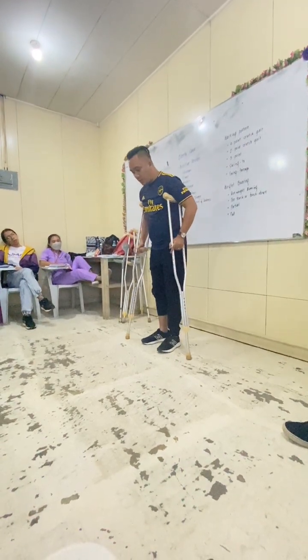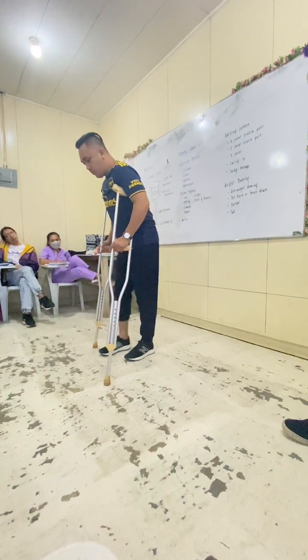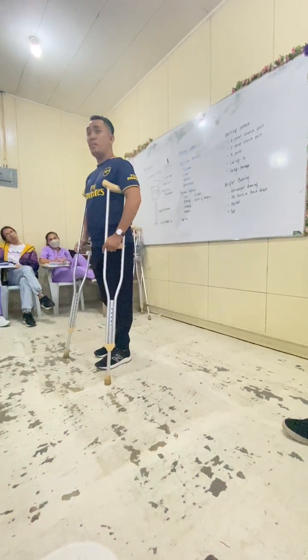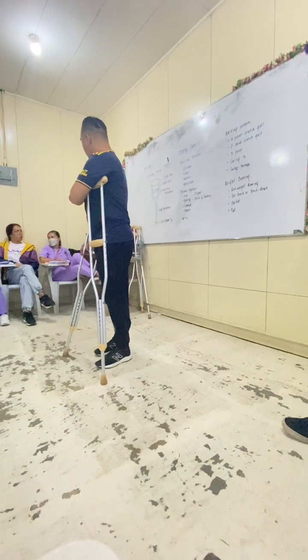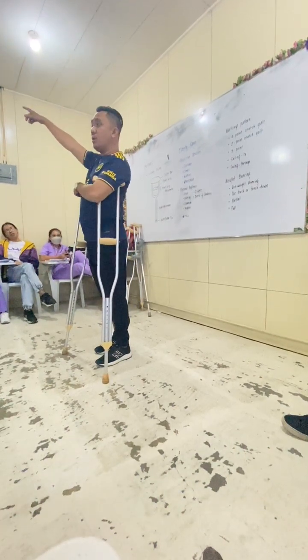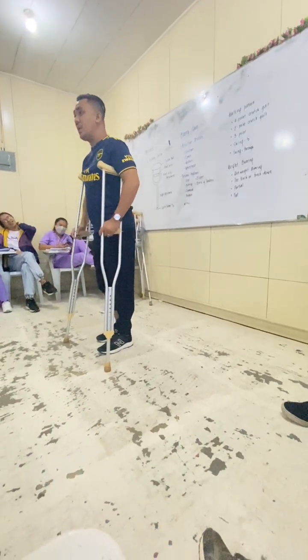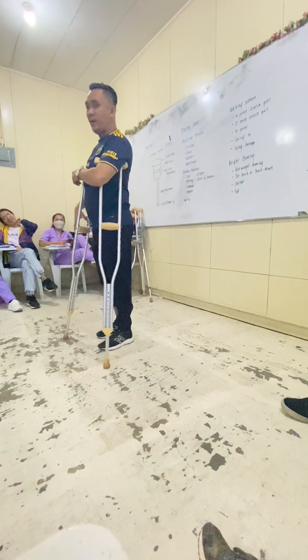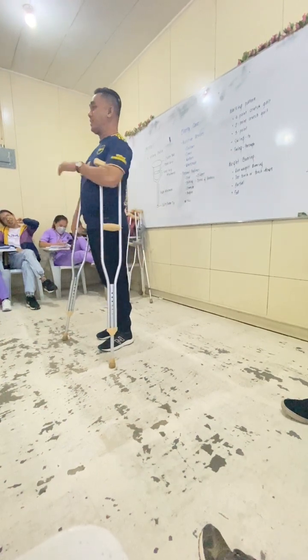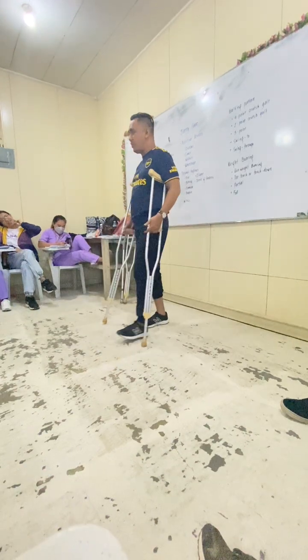Imagine na maglakaw sila. 1, 2, 3, 4. Imagine na kung tawag na, maglakala ka mag 4-point. Nag-lunch na lang eh, huwag ka mabot yung Jollibee. Na-out na lang eh, pagsaka pa ni mo sa building. That is the disadvantage again of using 4-point.